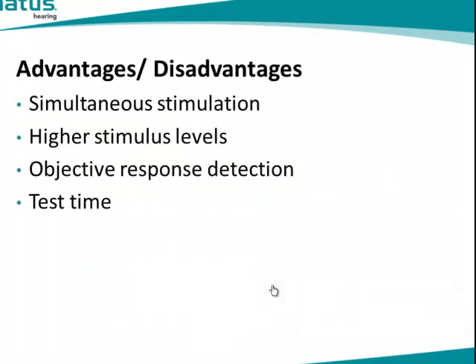Advantages to utilizing ASSR: of course, you can use simultaneous stimulation and higher stimulus levels. The software uses objective response detection, eliminating error in interpretation of waveforms, and test time can sometimes be much faster with ASSR because you can collect information on multiple frequencies at the same time.